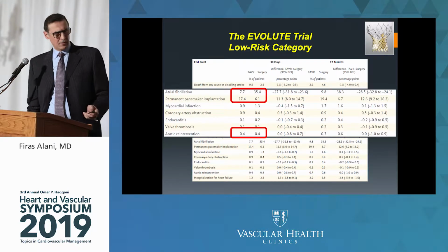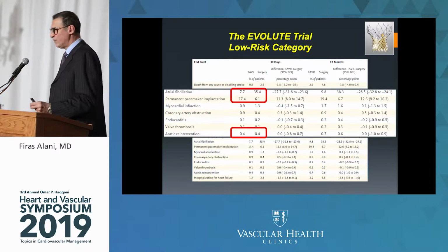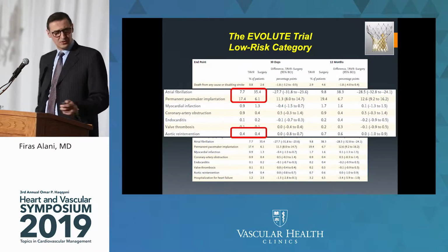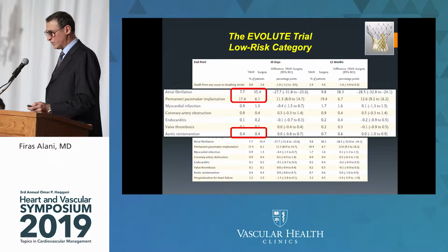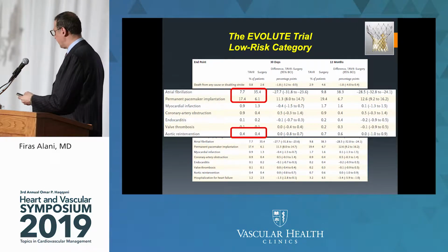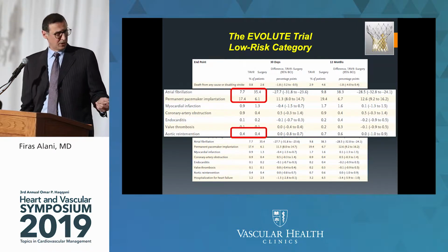Things to keep in mind with these procedures, which have some nuances to them, is pacemaker implantation. That has been inherently higher in the TAVR population. Again, this is a little bit higher with the Medtronic. We don't see that much pacemaker implantation with the Edwards valve, but contrast that with the onset of atrial fibrillation. We know these post-op surgical patients have a very high risk of atrial fibrillation.